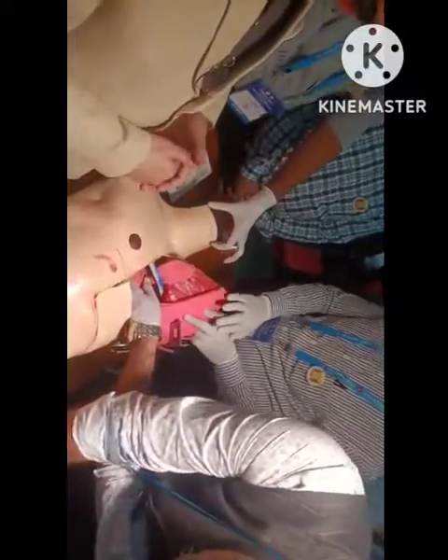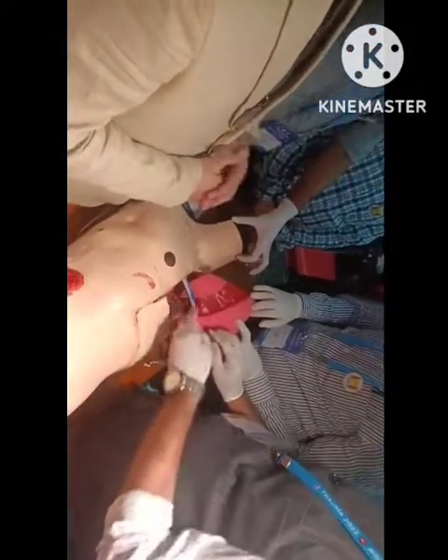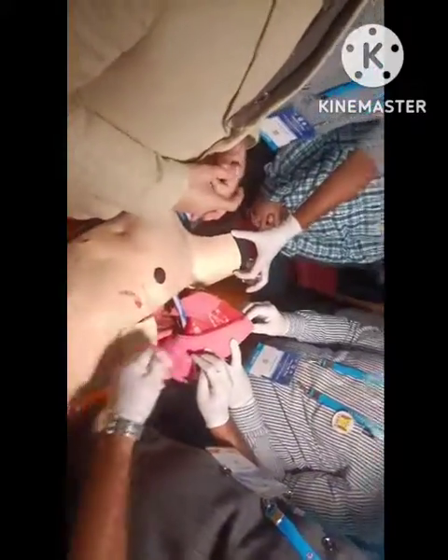Okay, so you have repaired your wound. Now, how much is the blood pressure, Akanksha? It is 100/70 now. Okay, his blood pressure has come up. Okay, improving, and after intubation it was already 95%. Now circulation has come. So now the vitals, if I repeat them, his saturation is 96%. Quite satisfactory. 100/70 is his blood pressure. Okay, and there is now pupillary reaction.